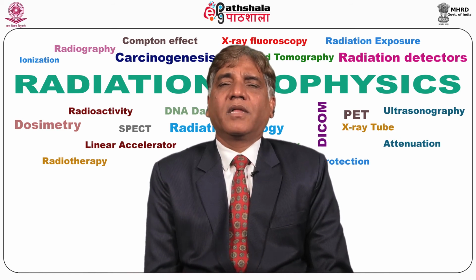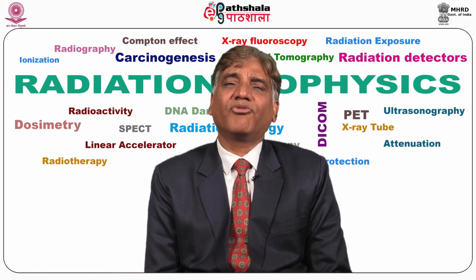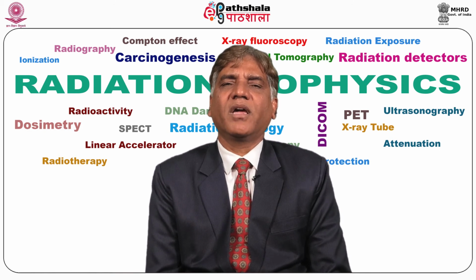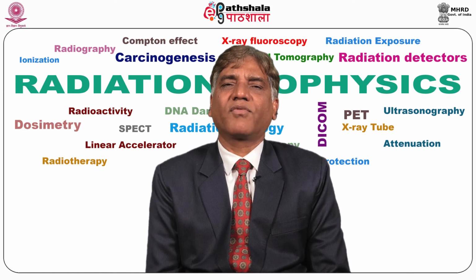The Doppler ultrasound uses the Doppler principle, wherein the frequency of the sound wave is perceived to be different from the transmitted wave because of the motion of the structure. For example, Doppler is useful in detecting blood flow. Blood is moving. Doppler may not be used for a stationary structure, because in case of a stationary structure, the frequency of the sound wave transmitted and reflected is the same. There is no change in the frequency, whereas with flowing blood there is a change in the frequency between the transmitted and received ultrasound waves, and this Doppler shift is utilized to get information about the blood flow.